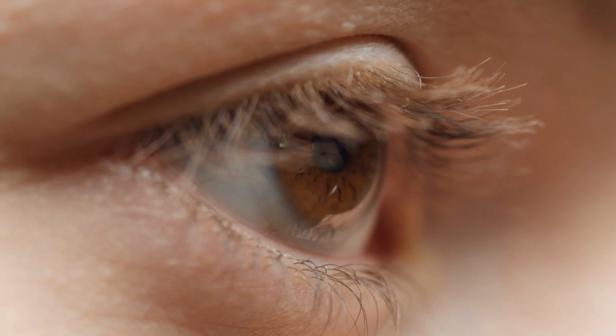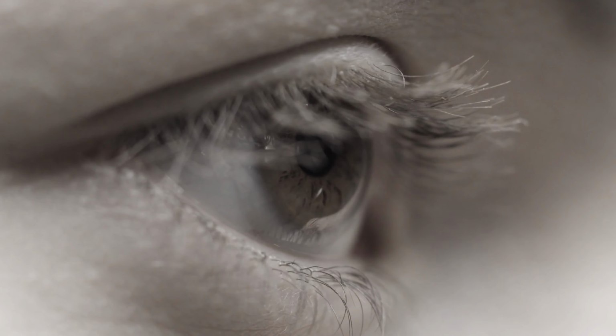They can only do so much, and over the course of a week to a month, the lack of hydration, the lack of moisture is gonna make those contact lenses a lot less comfortable. Going back to point number 1, this is why a daily contact lens is the absolute best option because it's a fresh lens every day.